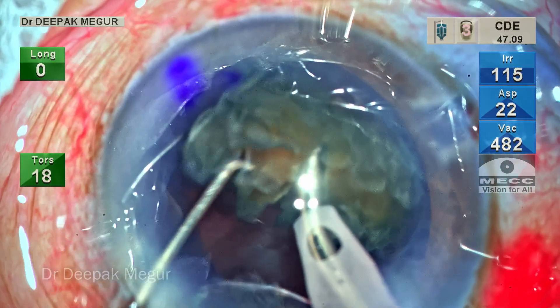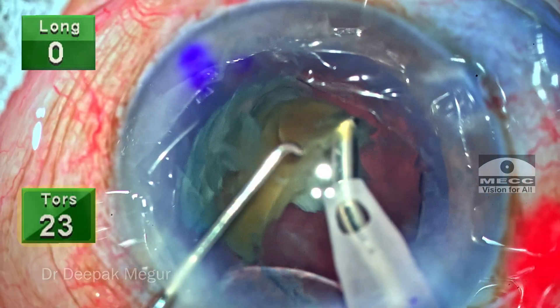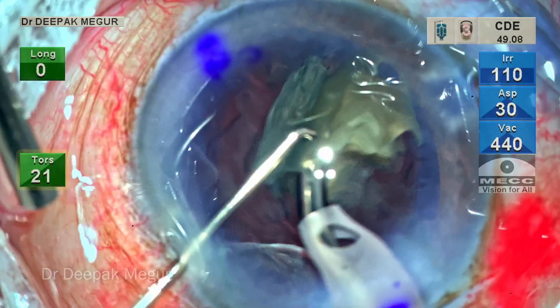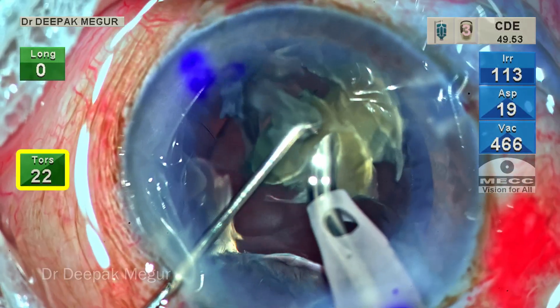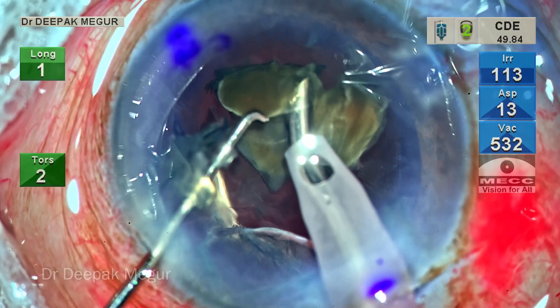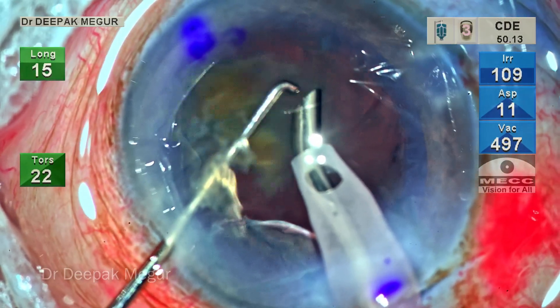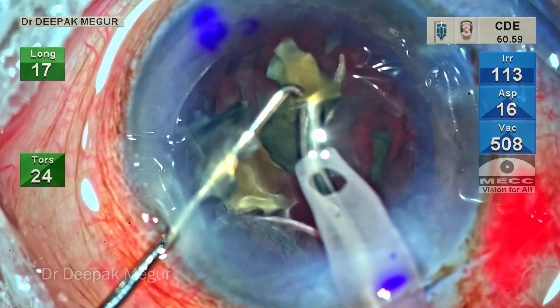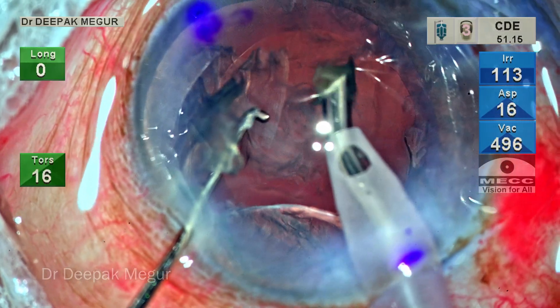Watch the position of my Sinskey hook, kept on top of the fragment, and monitor the power used. Although my available peak power is set at 60%, I'm using just 20%, ensuring better control. Slowly but surely the nuclear fragment dances around the phaco tip and eventually gets emulsified. A little patience ensures a great outcome as far as first-day post-op corneal clarity is concerned. Finally, all the fragments are emulsified.